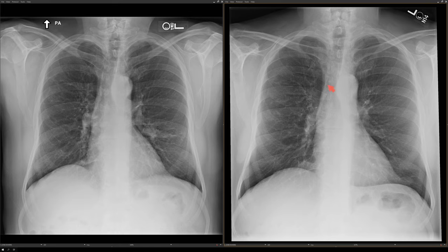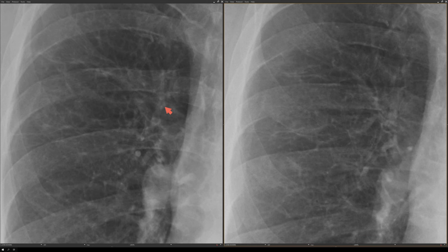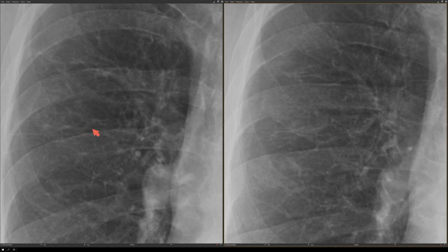Let's zoom in a little bit on this reticular area. With this area enlarged, I think you can better appreciate that this area of reticulation should probably be better characterized as bronchiectasis. We have a bronchus right here that appears dilated, and we also have a bronchus that goes out in this direction. This is the lucent area, this is the superior wall of the bronchus, and this is the inferior wall of the bronchus.